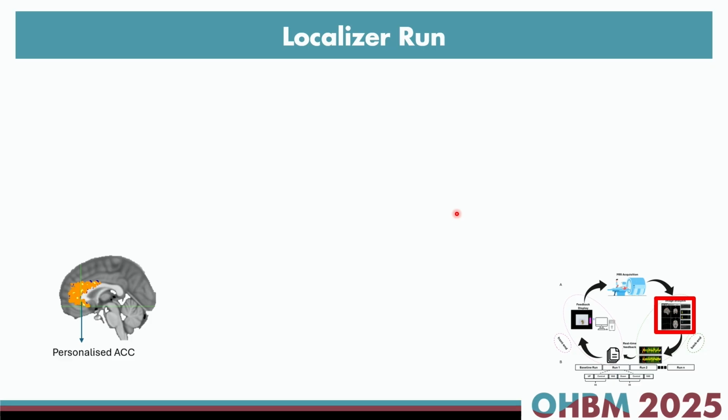So as you can see here, there are those yellow dots within this background of your ACC that are, let's say, the personalized voxels within ACC for each participant. That will be the place that this change in activation for neurofeedback will come from. But this data might be noisy, correct? We need to also think about and pay attention to any sort of physiological noise.